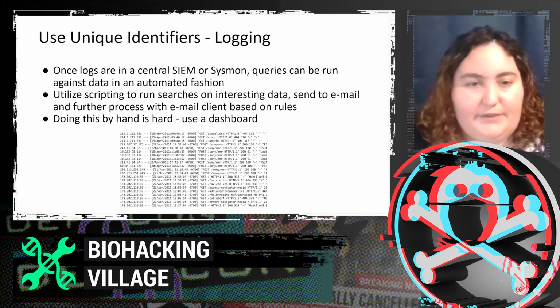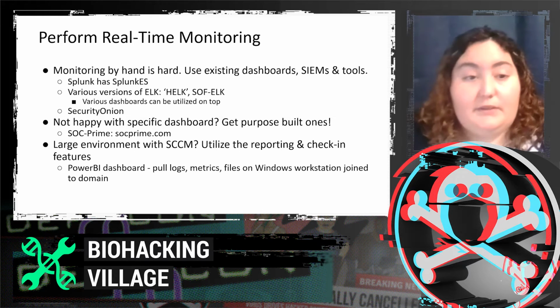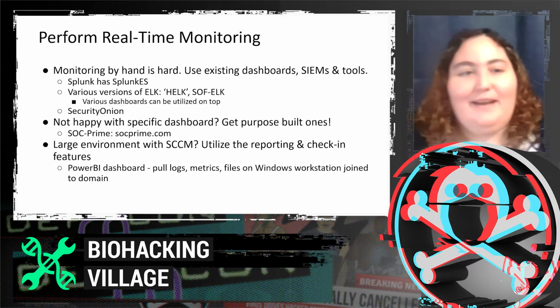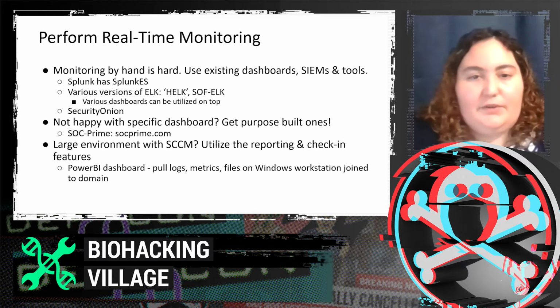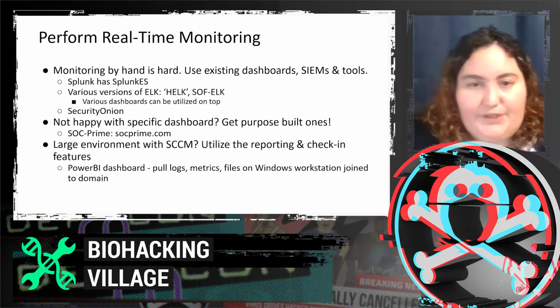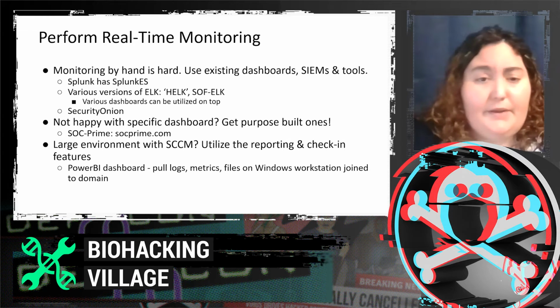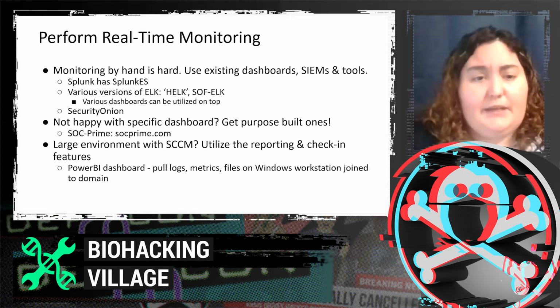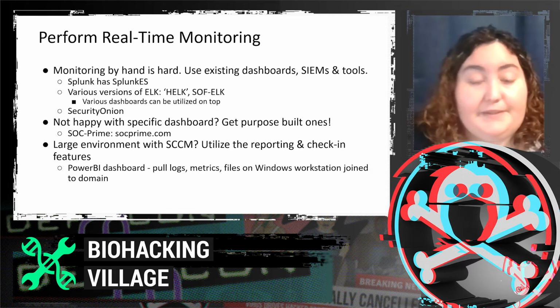You're not going to want to do this by hand, use a dashboard. Perform real-time monitoring. Again, you're not going to want to do this all by hand. You're going to want to have some dashboards, deploy automation when possible, and work with your vendor if you can. If you're using a free version, those are often supported by robust communities, and reach out to the community.